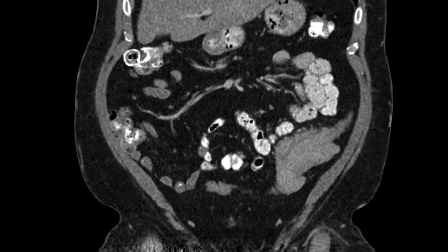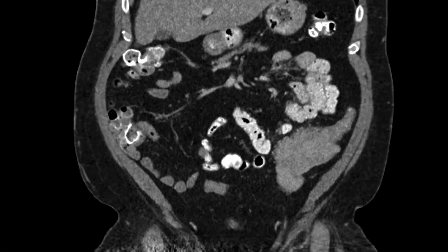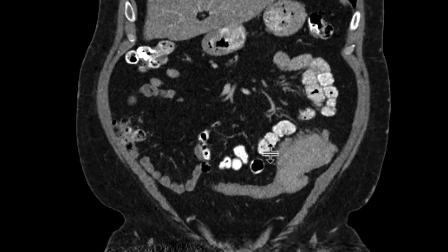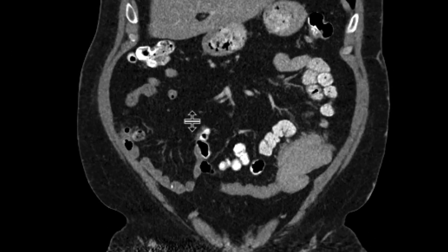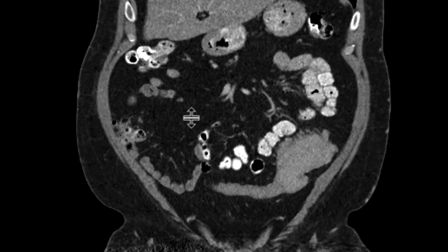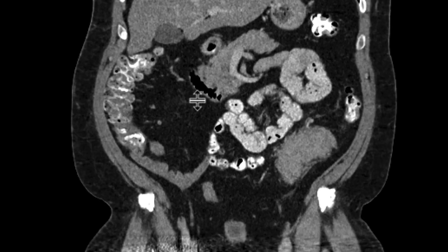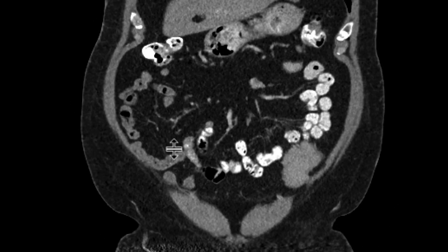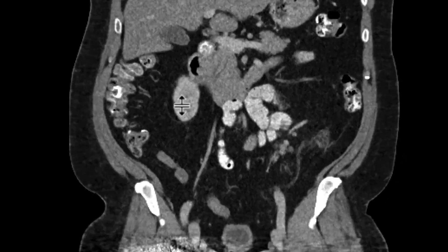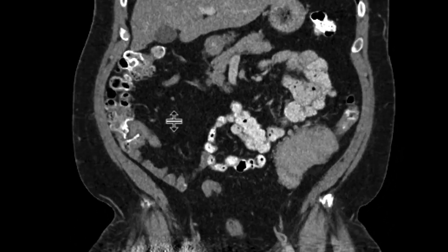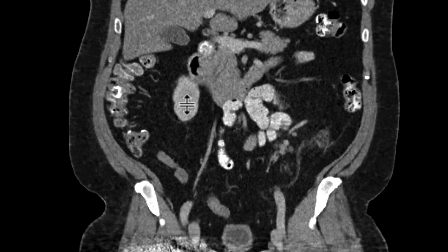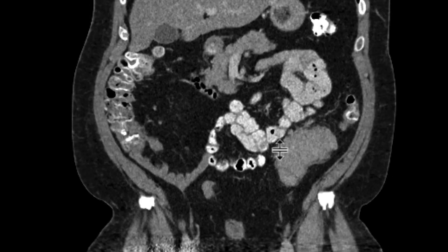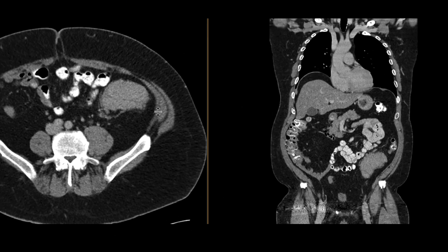You can see it on the coronals as well — how the descending colon and the sigmoid colon are really passing through this region, the soft tissue mass, unperturbed. There's no bowel obstruction, there's no bowel distension, and there's a little bit of adenopathy associated with this as well.